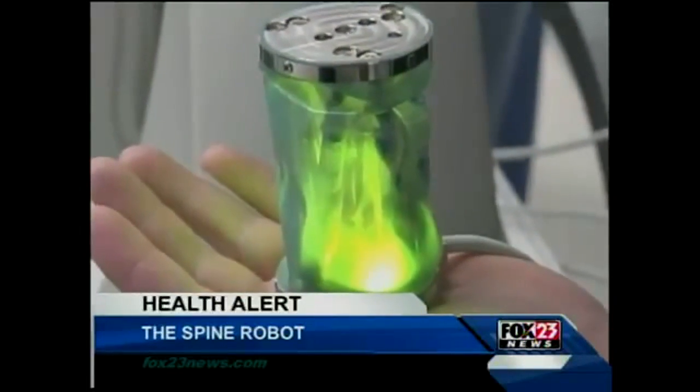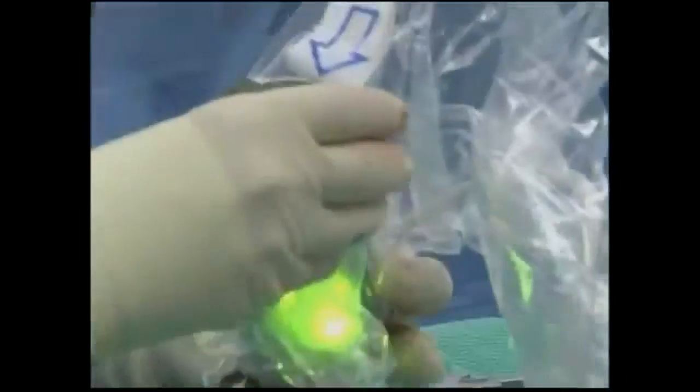This green glowing robot fits in the palm of your hand, but it's designed to help your back.